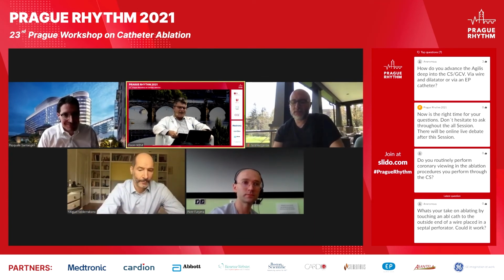But at least I have one question. Clearly, multipolar mapping is predominantly used for activation mapping. But if we want to display voltage in a traditional setting, like we use for mapping with regular catheters, with 0.5 and 1.5 for VTs, what should we use when mapping with, let's say, AcuNav or DecaNav or PentaRay? Are there other settings, or how to adjust?